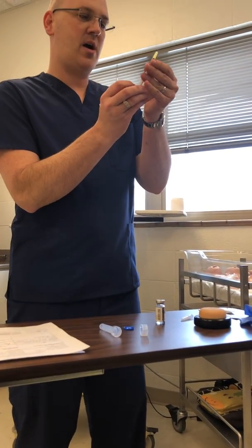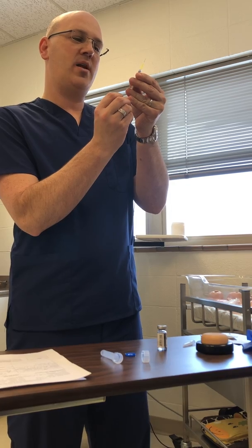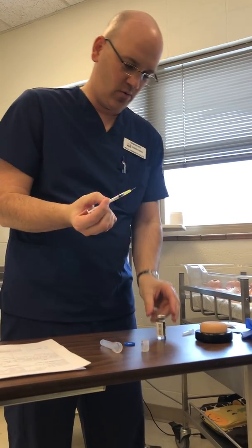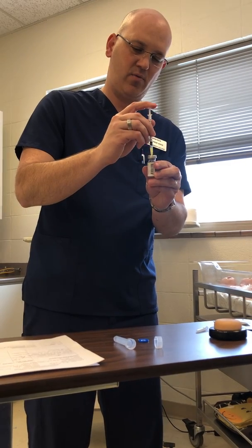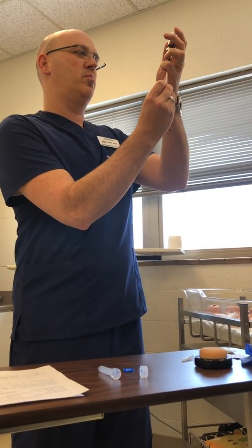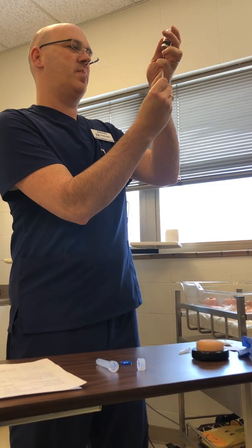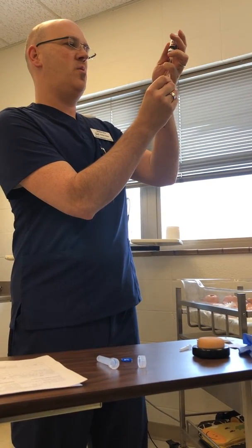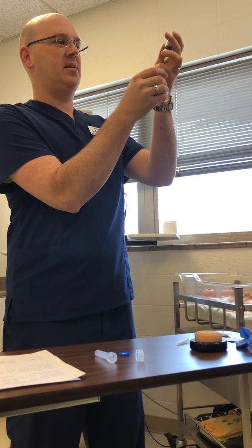We're going to draw up 0.1 amount of air, and we're going to put that into our vial to make removing the liquid easier. We're now going to pull back vigorously and get a 0.1 dose.